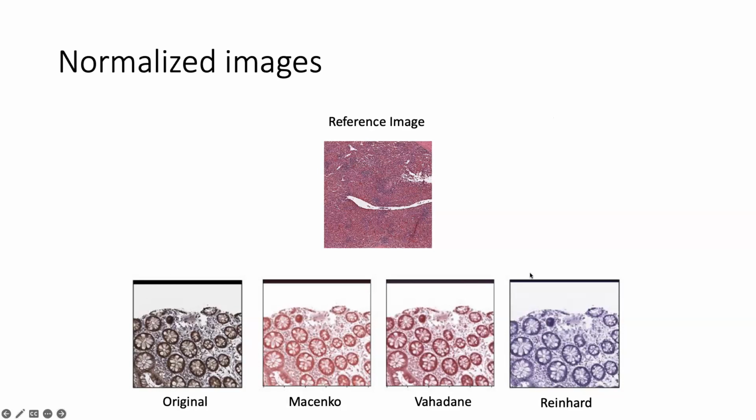I noticed how different each normalized image was from each other. I found that pretty interesting. And we can also notice that from the original image, there are some dips in image quality because of that normalization process, which is completely expected.